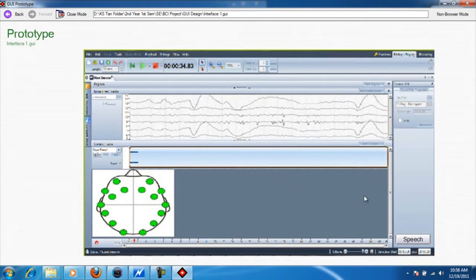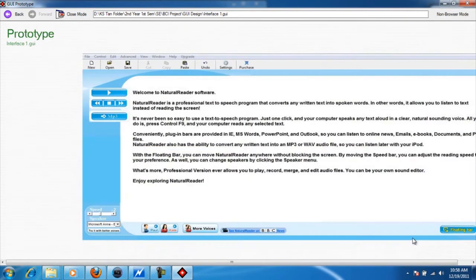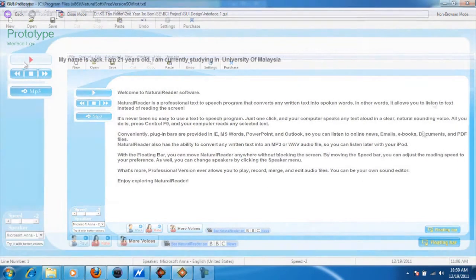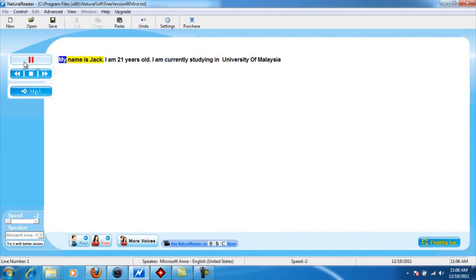Once the translation is completed, we can proceed to the text-to-speech system. In this system, the translated text will be converted into an audio file, which allows us to understand what the brain wave signal meant. For example: My name is Jack. I am 21 years old. I am currently studying in University of Malaysia.